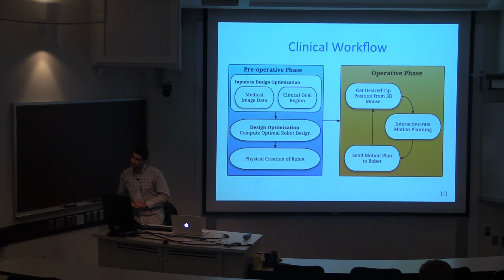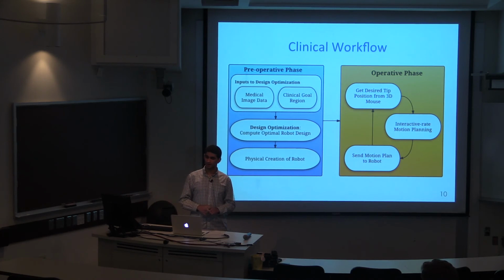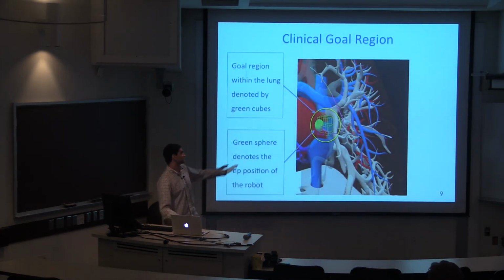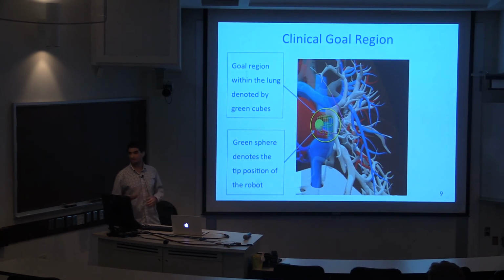So what type of information is the tube transmitting? The robot, after it reaches the goal? Oh, after it. So this is all in simulation right now. But in this picture, we can see that the cube that is reached is marked as blue, so it's marked as reached. At the end of the evaluation of this design, we would look at all of the reached cubes and take a fraction. For instance, there are 4 cubes here. If the robot reaches 3 of them, that yields a 75% reachable goal percentage rate.